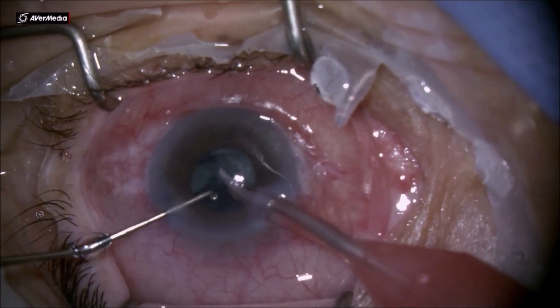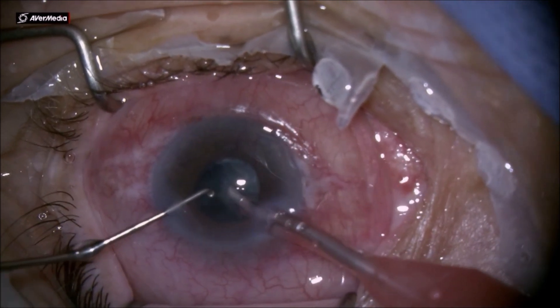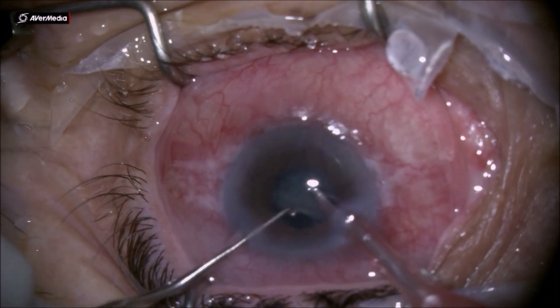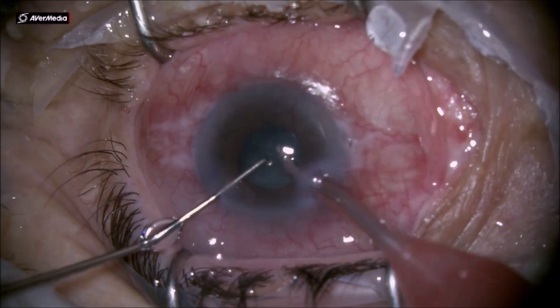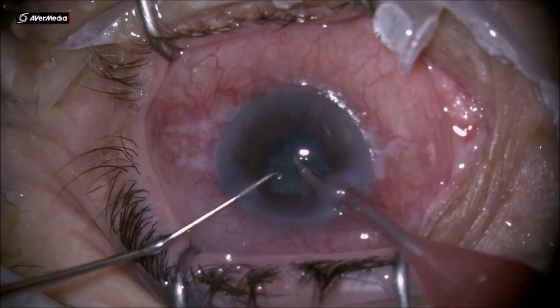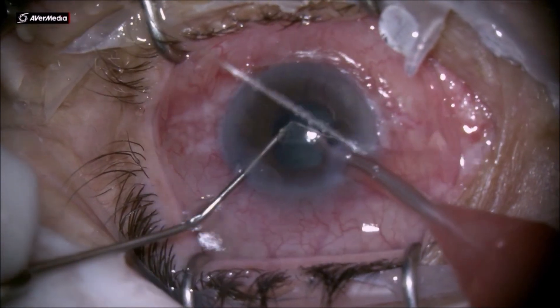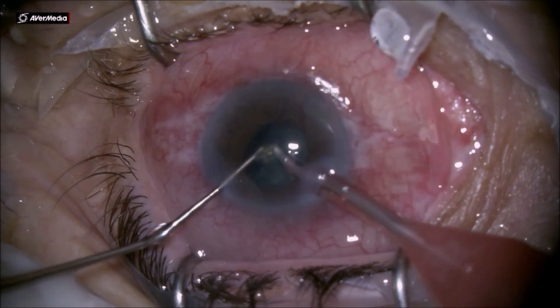It's a complicated surgery anyway. You have to be very careful at the foot pedal — don't keep it pressed for long periods of time since you're working in a very small environment. You have to do phacoemulsification at the iris plane, or if possible, it's better to do it inside the bag in order to be as far as possible from the cornea.